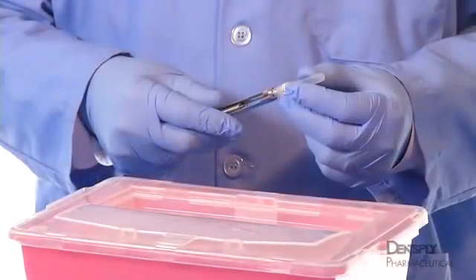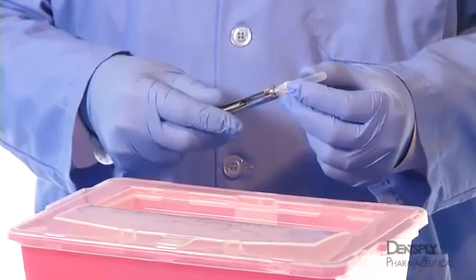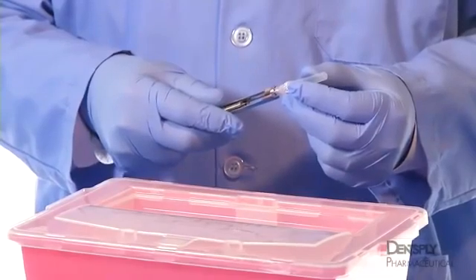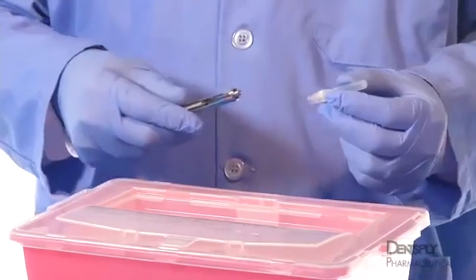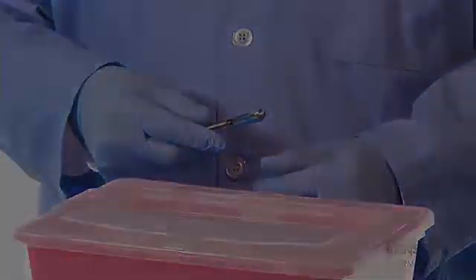Approved sharps containers are mandated to dispose of contaminated needles, cartridges, and other sharps. The containers should be properly disposed of according to federal, state, and local regulations.